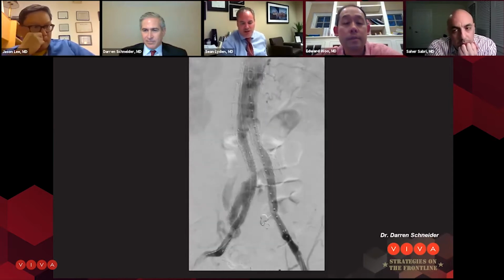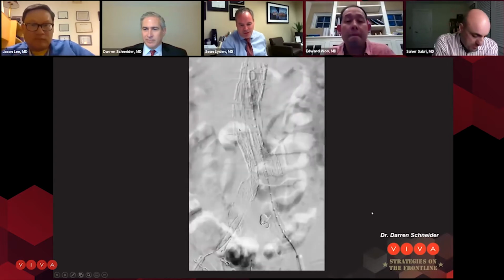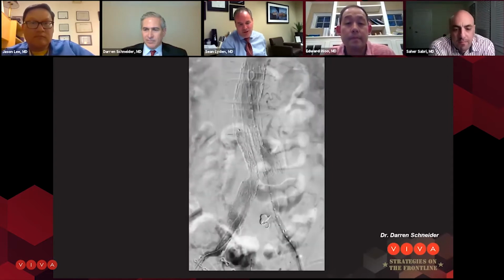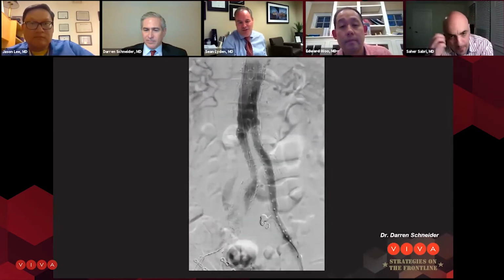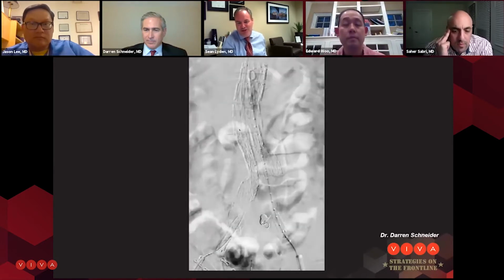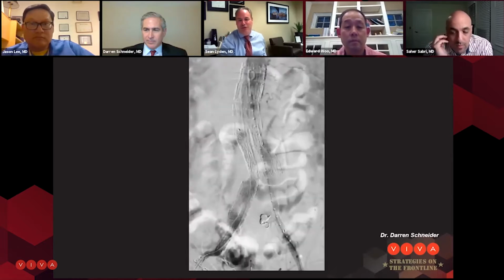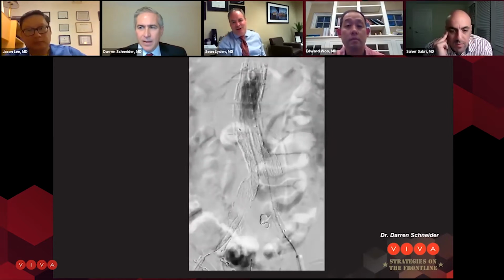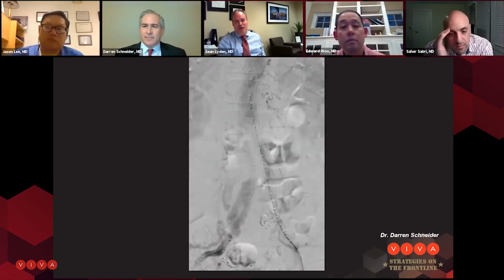I want to make sure the attendees get something here, but I think one of the key points we talked about is the limbs and how kinked they were. One of the important parts is he's got basically a catheter on one side, a floppy wire on the other side. So he's going to let these devices lay in their normal position, because we don't want to be straightening out a kink with stiff wires when you're taking your completion pictures. And then you come out and, post-op day 2, they thrombose. We've all lived through that learning curve, and sometimes people forget that step. To me, that's always the most important thing: look how nice and straight they are at the end result here, which is awesome.